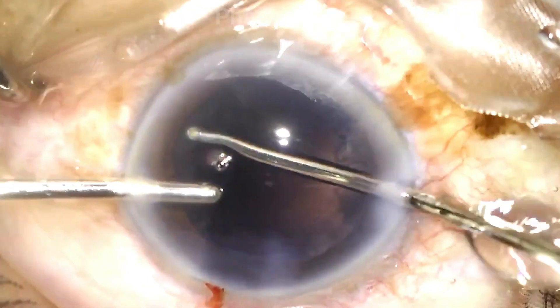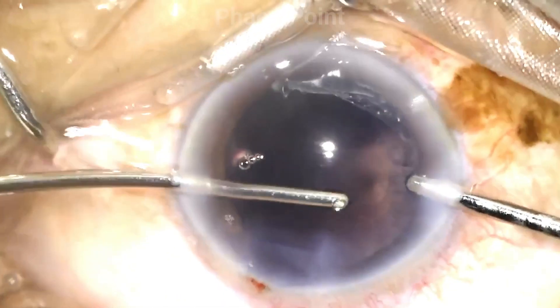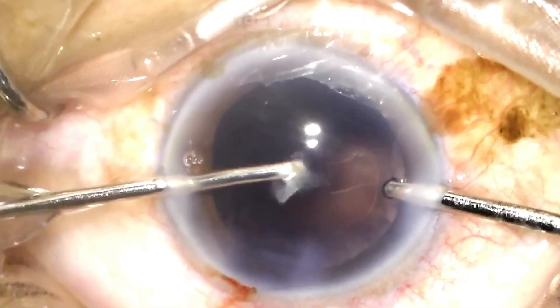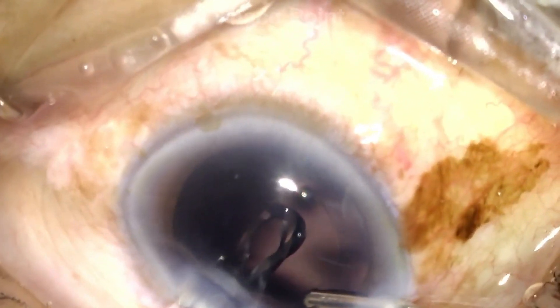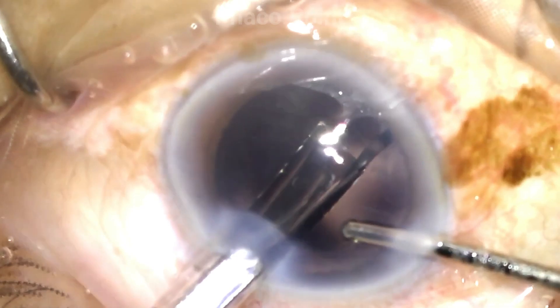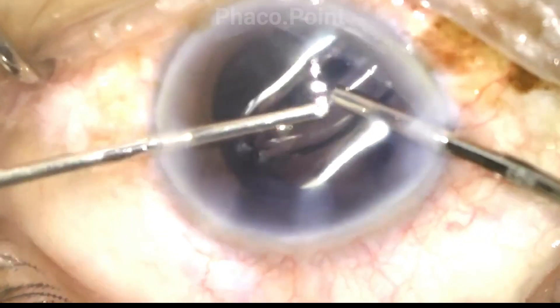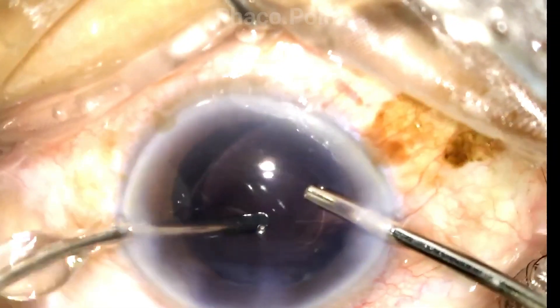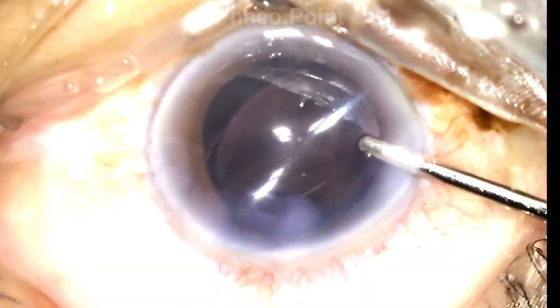In a patient with a smaller capsulorexis, a bimanual irrigation aspiration system for removal of the cortex is preferable because of the ease of gaining access to the peripheral cortical tissue. Upon completion of the irrigation aspiration, I now proceed to introduction of the single-piece monofocal IOL in the capsular bag. Sometimes this can be a struggle because negotiating a larger, slightly more rigid lens through a tiny capsulorexis edge has its own challenges. To facilitate the ease of injection of the IOL within the capsular bag, it is imperative that the capsular bag is well insufflated with viscoelastic.